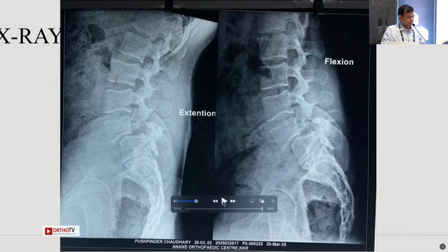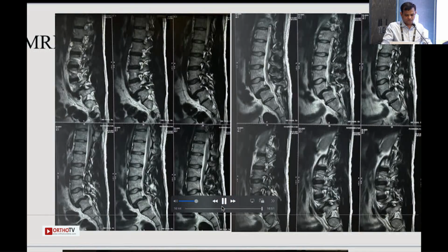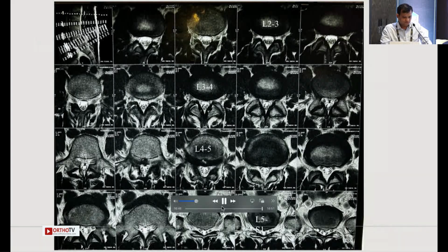Having used the robot for quite a while now, I found the real big advantage is that you can reproduce the results. Once you know the system well, you can reproduce the results and your juniors can put in the screws. And it's better than anything you would have done freehand. I think that's possibly going to be the change in the future. So that's another case.